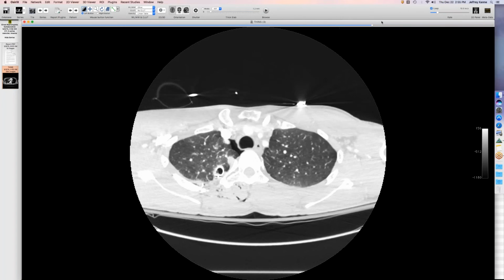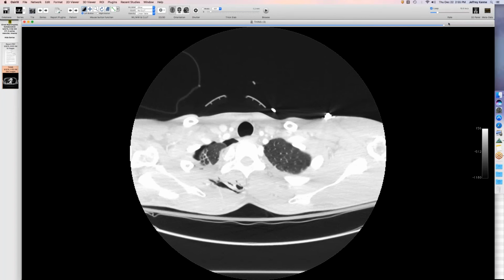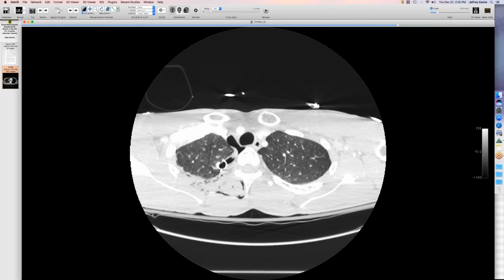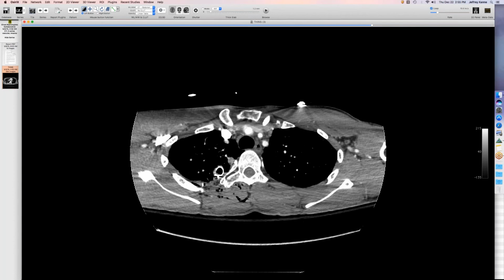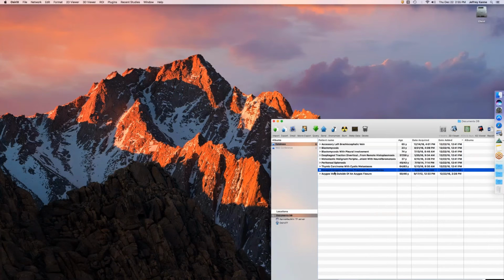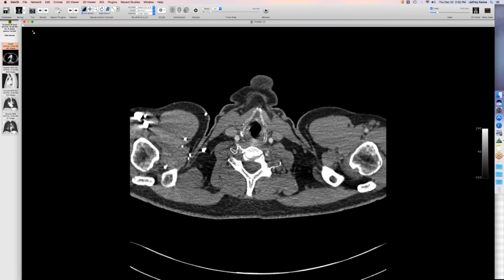But the difference with my case is I don't have that accessory little mesoazygos that you had, because the tiny one is just hanging out there on its own. So I think yours is truly an accessory fissure with an aborted azygos fissure. And then here's another one. This may be a case.